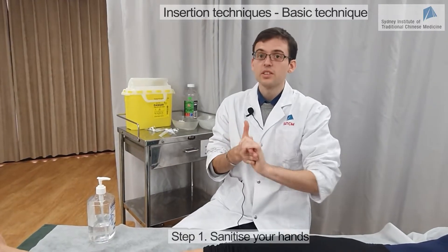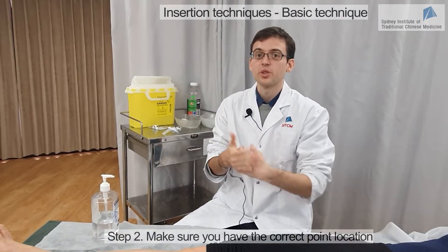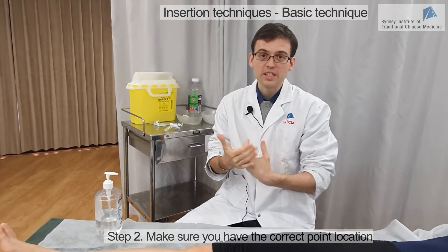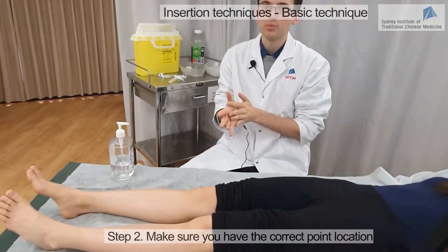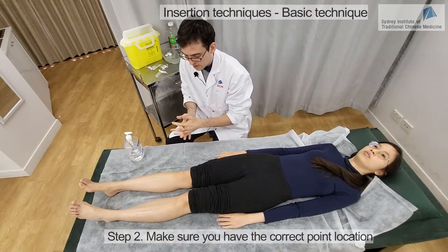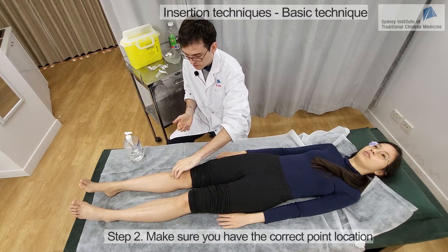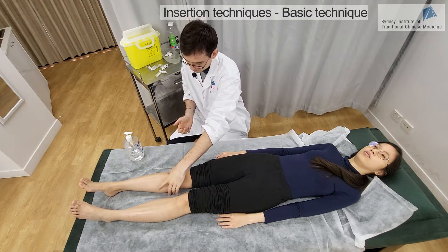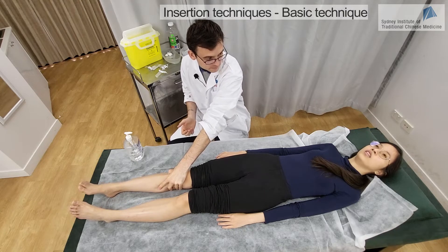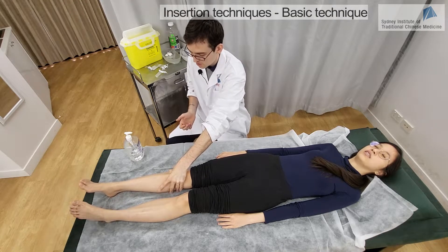Before you insert the needle, you need to make sure you have the correct location of the point. There are basically two ways of doing that: the first is through body landmarks, and the second is through palpation. Today we're going to needle on Stomach 36. So I'm going to press — do you feel anything when I press here? It's a bit sore.